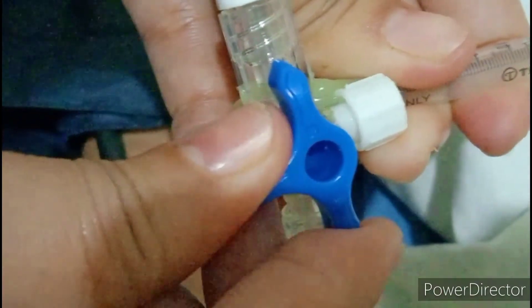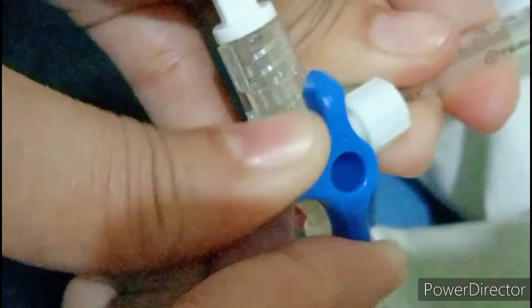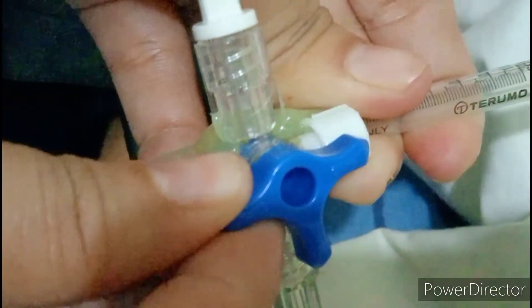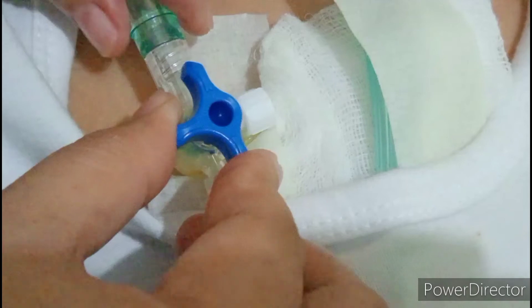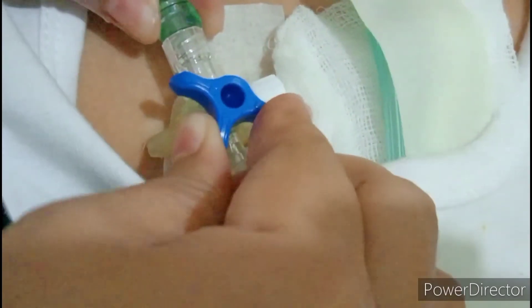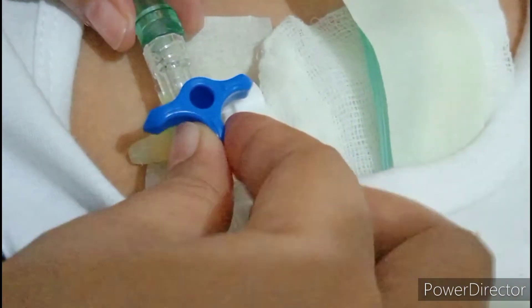After obtaining the central venous pressure value, turn the stopcock to resume the IV infusion as indicated. Confirm the stopcock is turned so that the IV solution port, central venous port, and the client's port are all open.